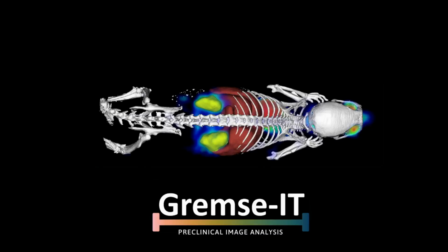Hello and welcome! Did you know that our Imalytics Preclinical software comes with several handy shortcuts? In this video I'll show you how they work and how they can make your image analysis workflow faster and easier. Let's start by opening the software.